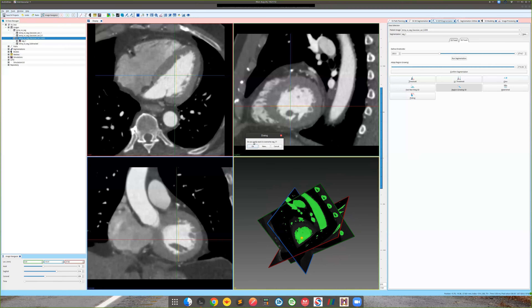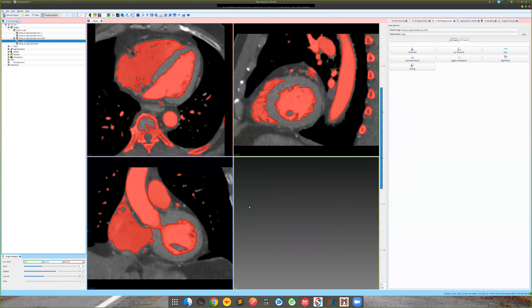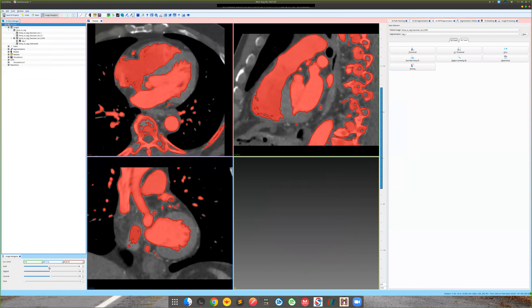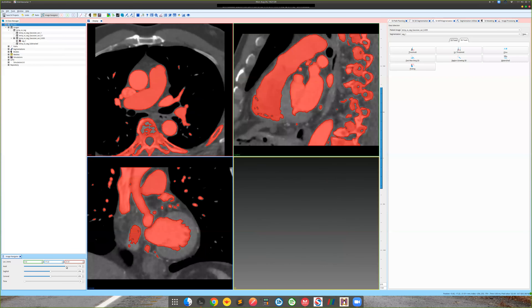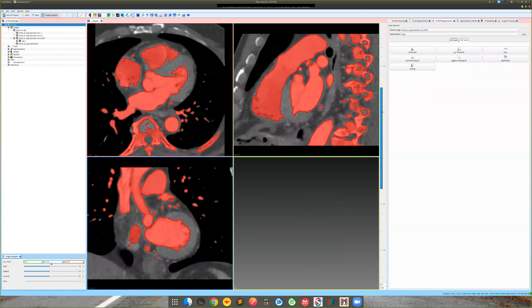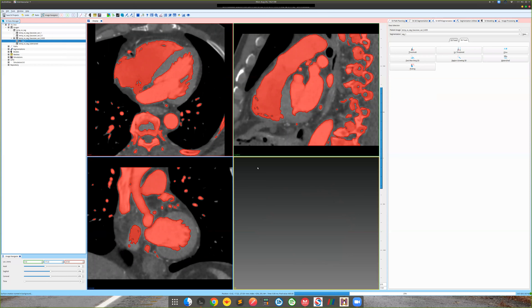Let's confirm this segmentation — overwrite it so it shows up. You can see it includes not only the left ventricle but lots of the right ventricle, with lots of holes and other features. We can quickly generate a polygonal model — right-click on the segmentation and choose 'Create Polygonal Model'. It takes some time because there are lots of regions. Let's name it 'seg1'.